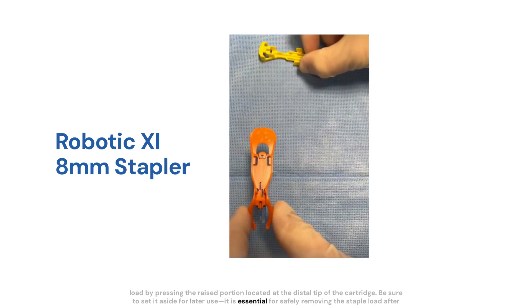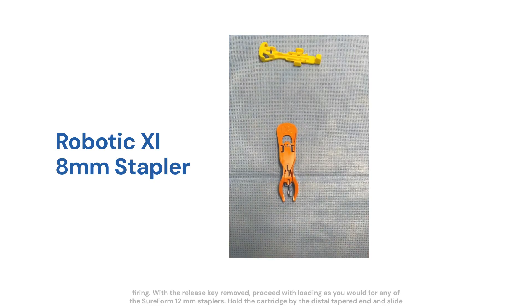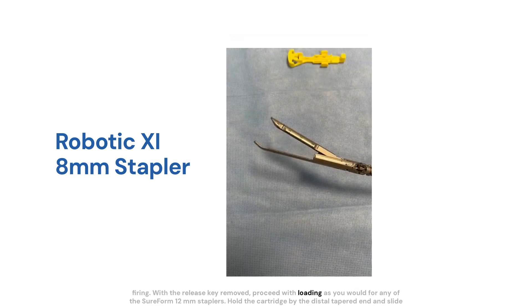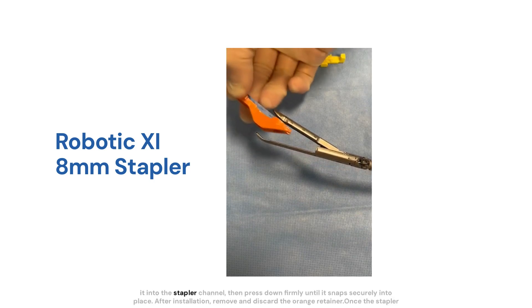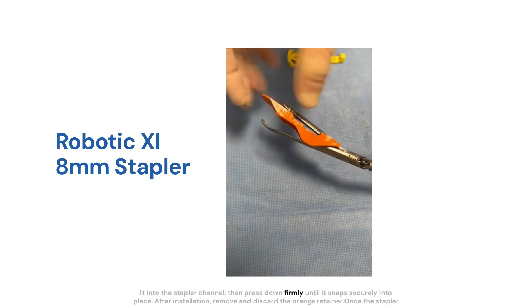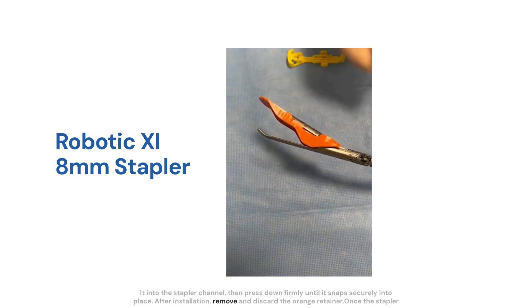It is essential for safely removing the staple load after firing. With the release key removed, proceed with loading as you would for any of the SureForm 12mm staplers. Hold the cartridge by the distal tapered end and slide it into the stapler channel, then press down firmly until it snaps securely into place. After installation, remove and discard the orange retainer.